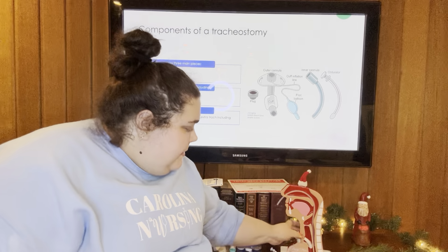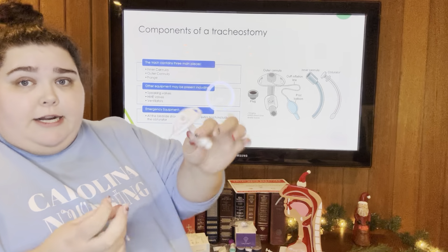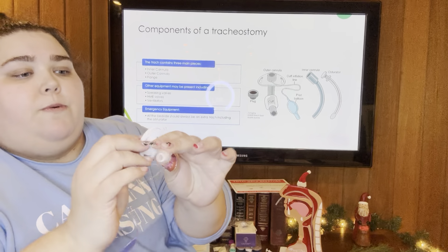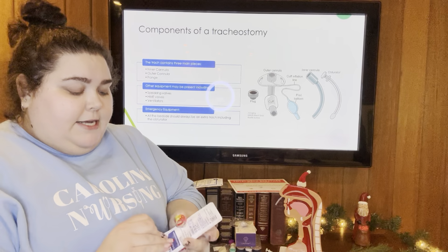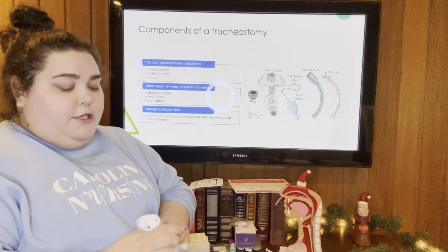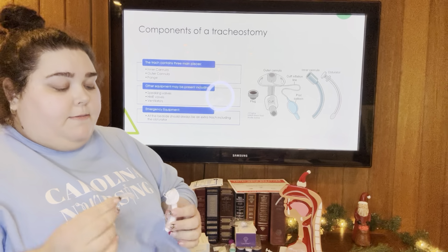So Tracheostomy Tom here, we're going to borrow his trach and go through the components. You can see he has a cuffed trach. He does not have an inner cannula in it currently, so we're going to open up an inner cannula. His cuffed trach is there so that we can put him on a ventilator if we need to. There are some other pros and cons that we'll talk about in a minute.